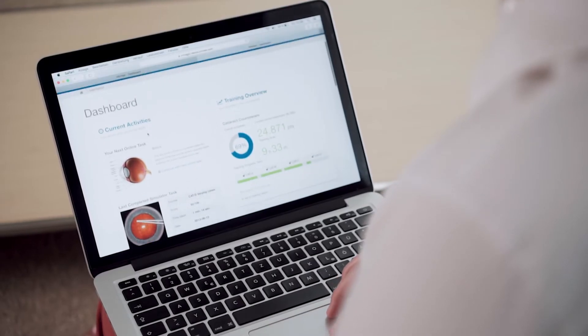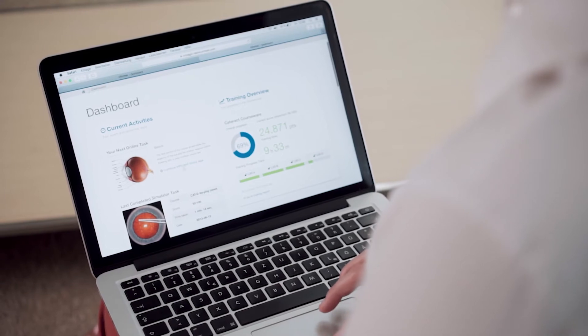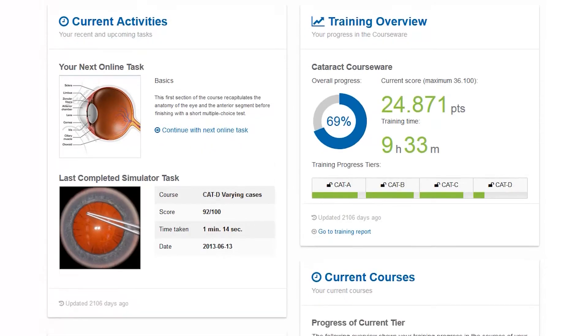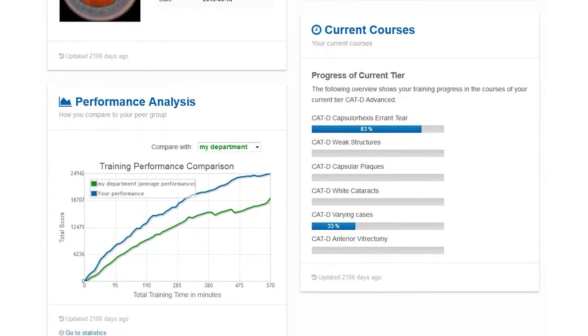Residents have access to a personalized VRM-NET dashboard displaying their current training status and online courses.